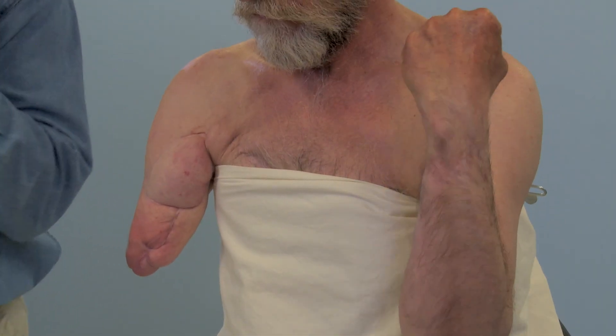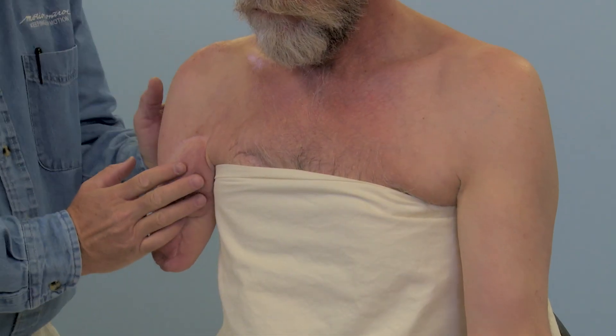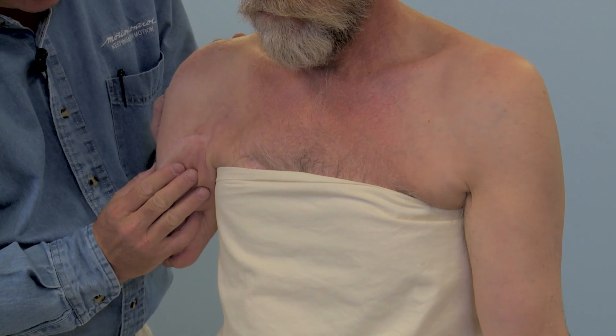Have the patient flex and extend the sound side elbow joint. As the patient does this, have the patient flex the biceps on flexion and the triceps on extension. Have the patient imagine flexing and extending the phantom limb simultaneously with the sound limb. As the patient does this, palpate the residual limb, feeling for muscle contraction.